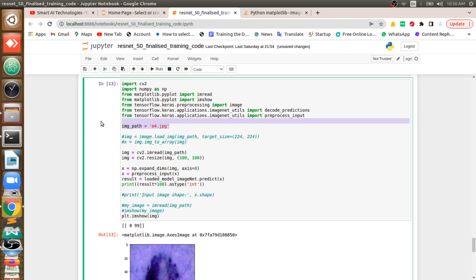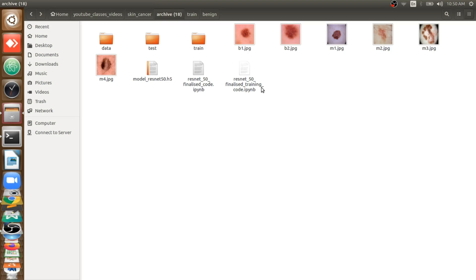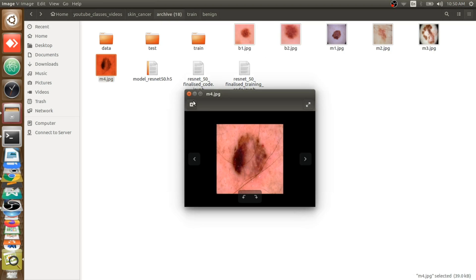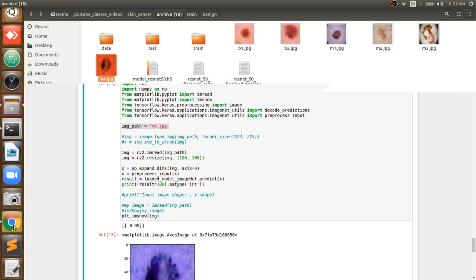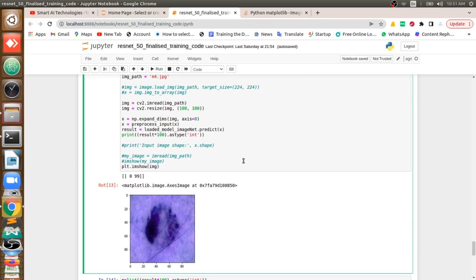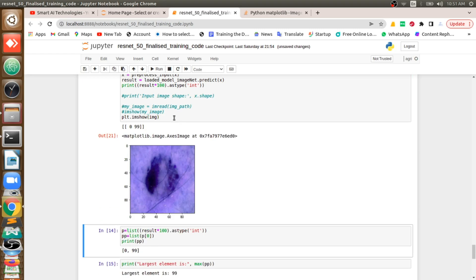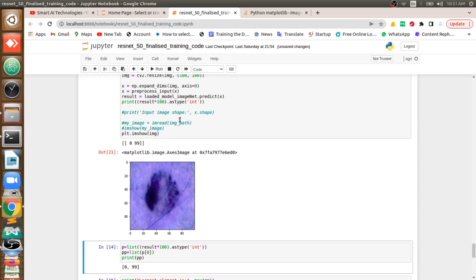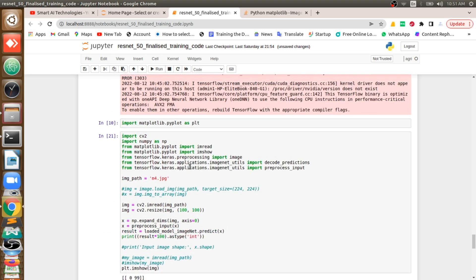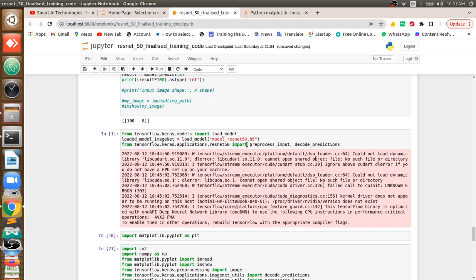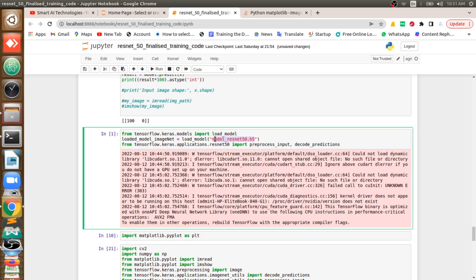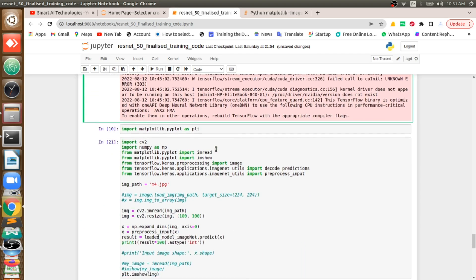Here I am importing an image, m4.jpg. You can see what that image is — this is the image I am feeding to my final model. I am displaying that image to show you. After feeding it, I am going to get the prediction done on my model. This model is ResNet-50.